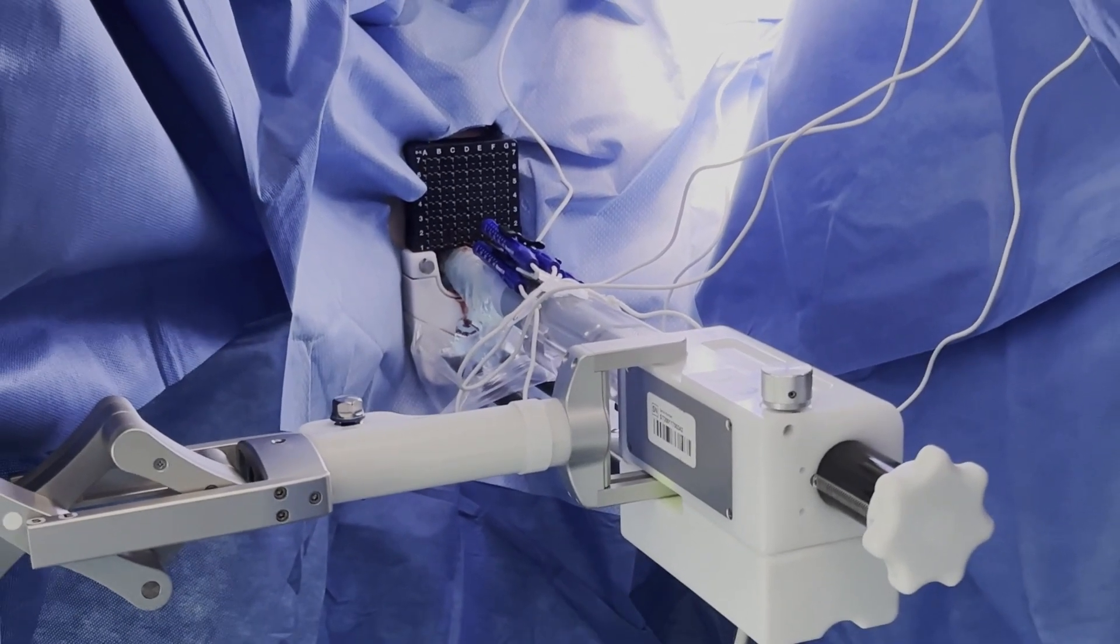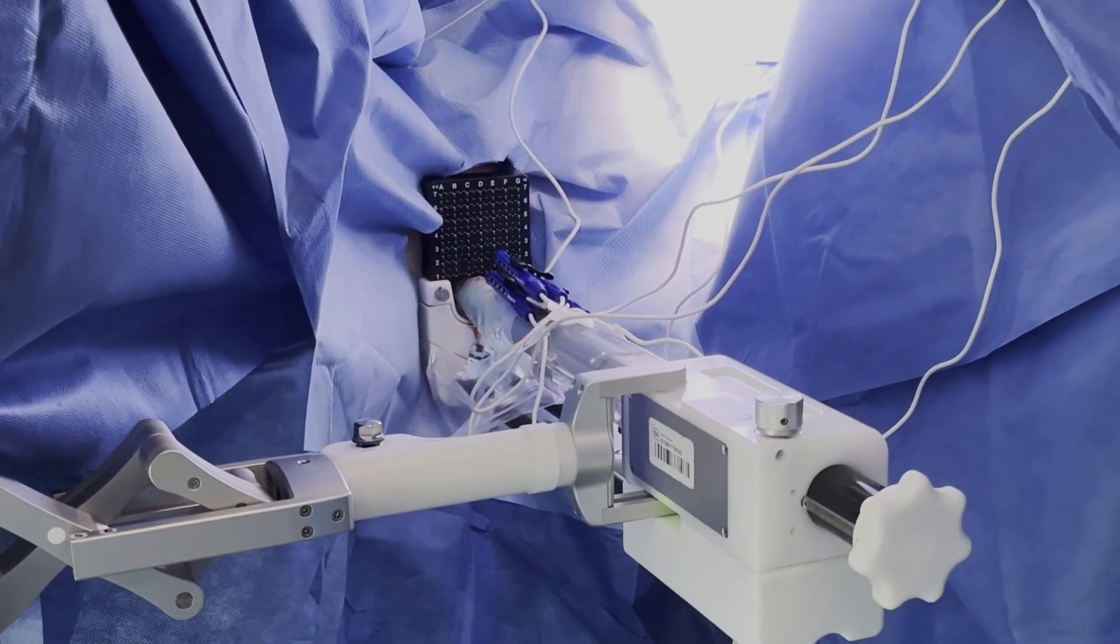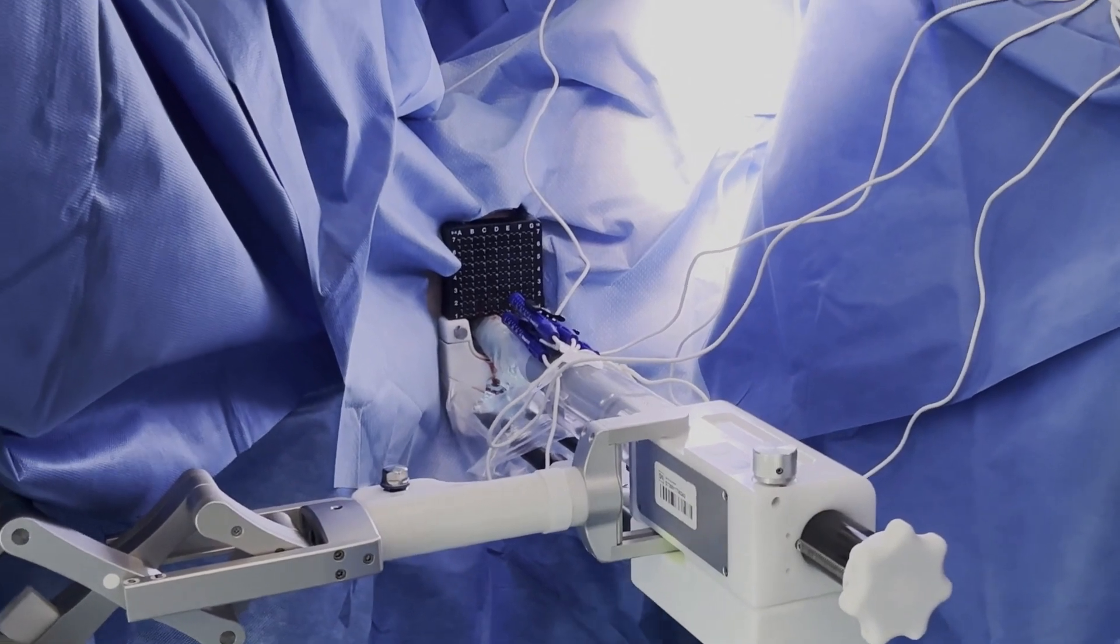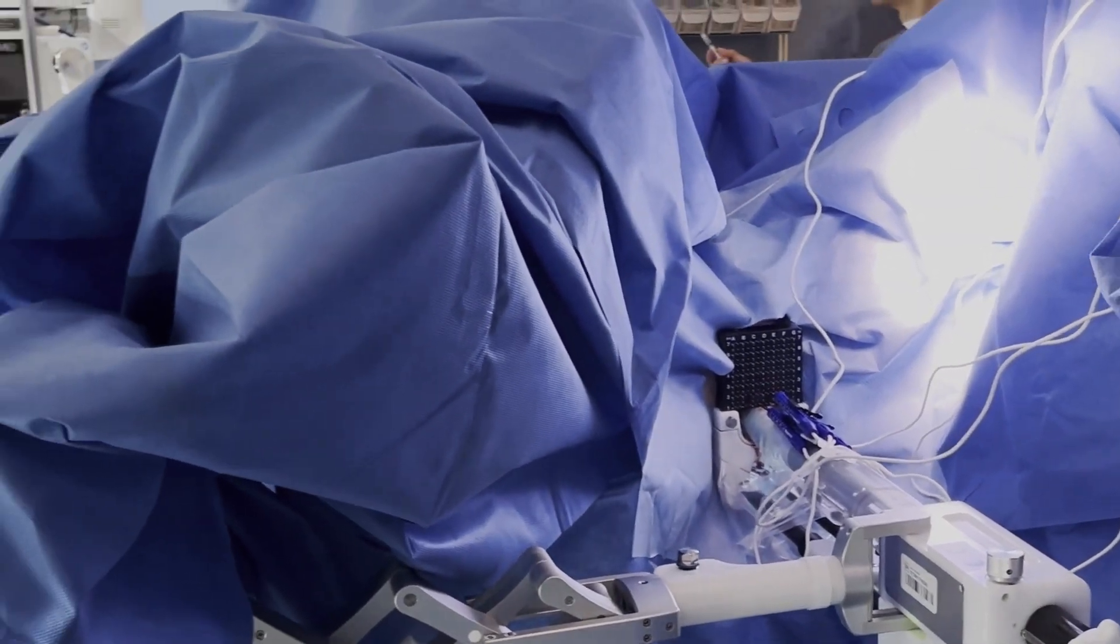The real-time ultrasound imaging can help urologists ensure that the target lesions are ablated as intended while providing the desired treatment margins.